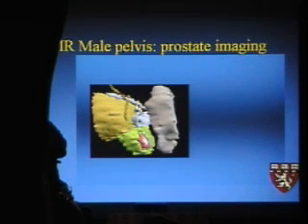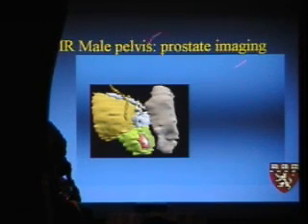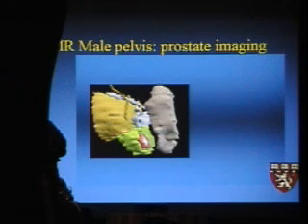And we're going to talk a little bit about the male pelvis. And primarily, the uniquely male disease that we image is, of course, the prostate and prostate cancer. And one of the reasons we use MRI in prostate cancer is, first of all, it's an extremely common disease. We require it because we're doing it for staging purposes primarily. We're beginning to do it more and more for diagnosis and detection of this disease.